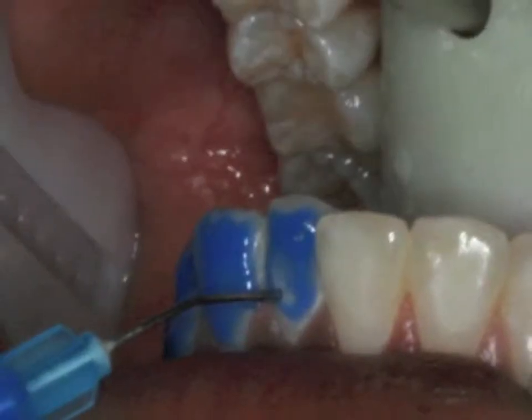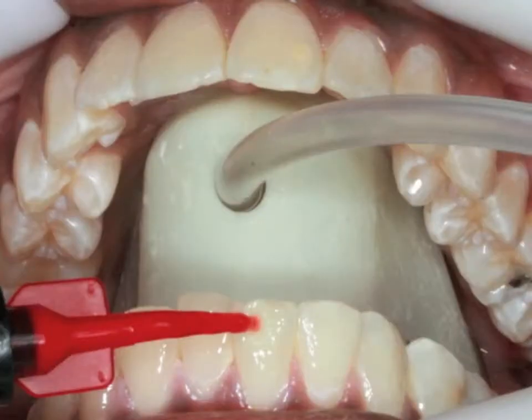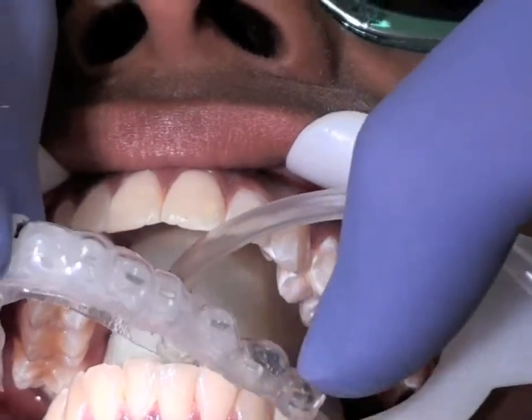The entire facial surface of the tooth is etched with Opal Etch, which is self-limiting and does not allow etching too deep. Opal Seal is painted on the rinsed and dried tooth surface, then air thinned.